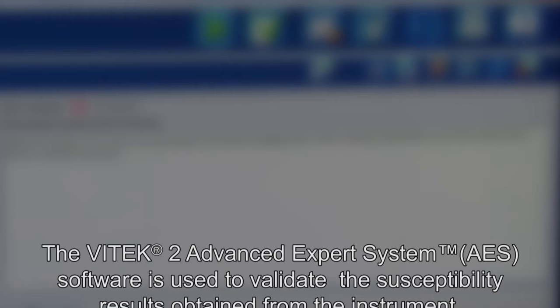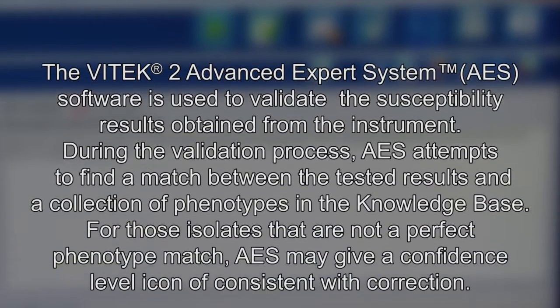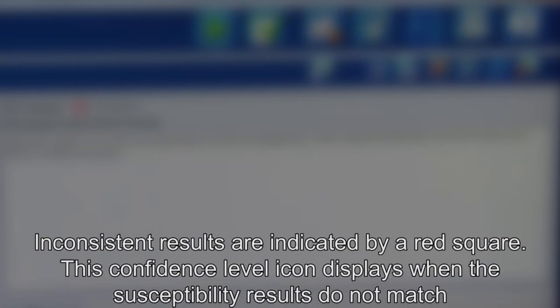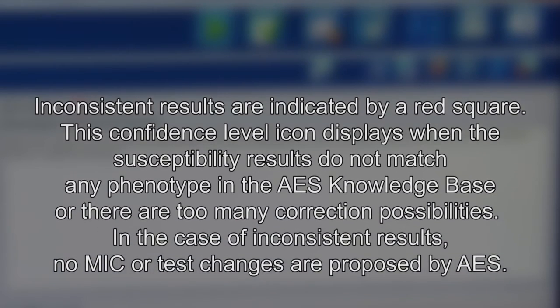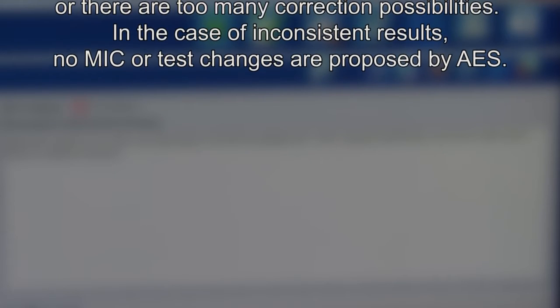In review, the Vitek 2 Advanced Expert System AES software is used to validate the susceptibility results obtained from the instrument. During the validation process, AES attempts to find a match between the tested results and a collection of phenotypes in the knowledge base. For those isolates that are not a perfect phenotype match, AES may give a confidence level icon of inconsistent. Inconsistent results are indicated by a red square. This confidence level icon displays when the susceptibility results do not match any phenotype in the AES knowledge base or there are too many correction possibilities. In the case of inconsistent results, no MIC or test changes are proposed by AES.